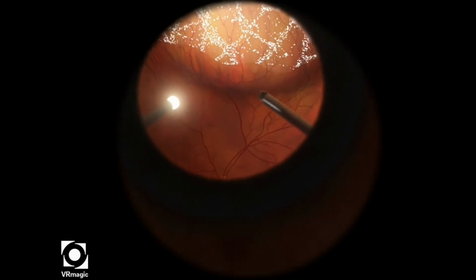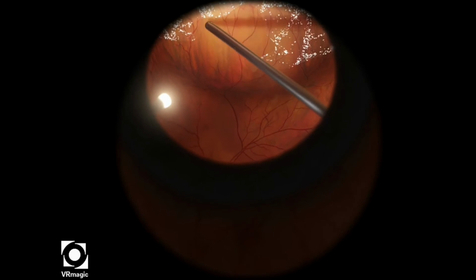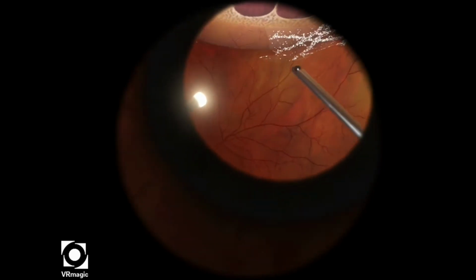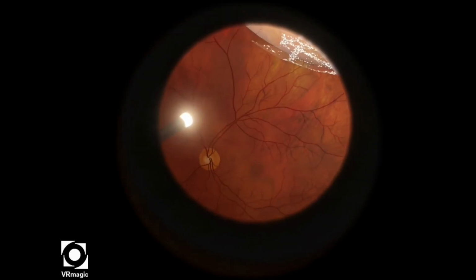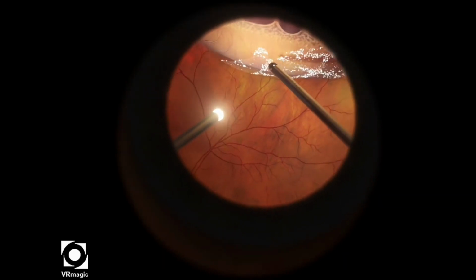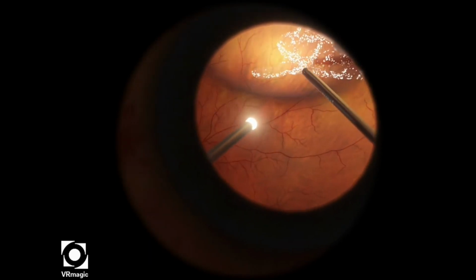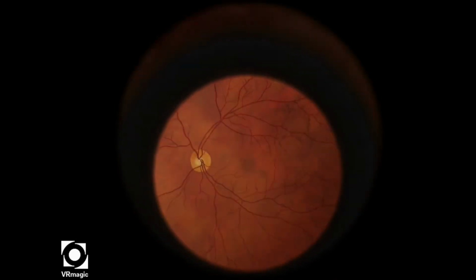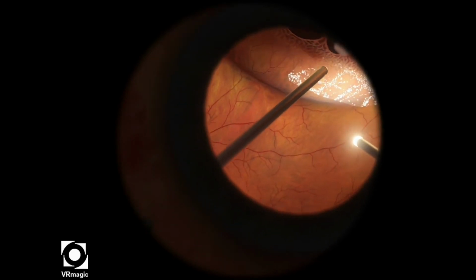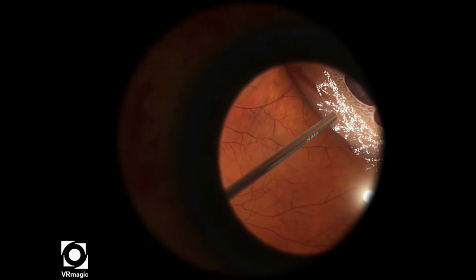So now that a lot of this is done, I'm asking my assistant, or changing it myself on the settings, to scleral depress so that I can get as much of the peripheral vitreous as possible. So you notice here I'm getting a very tight, close shave. My aspiration level in this case is almost down to 0, or pretty much 10. The reason is that any slight aspiration can easily induce retinal tears, and I've tried this level multiple times and induced a tear each time because my aspiration rate was too high.